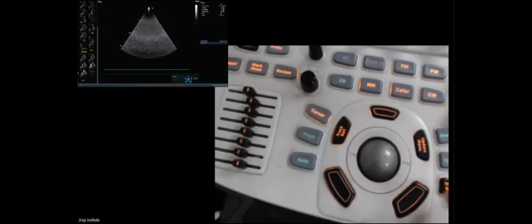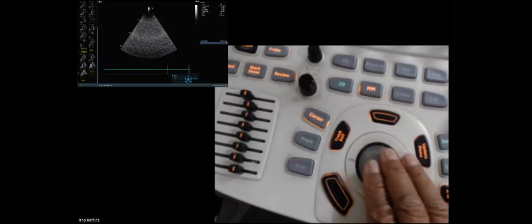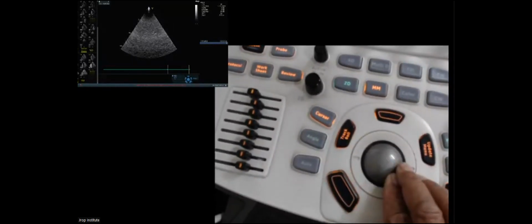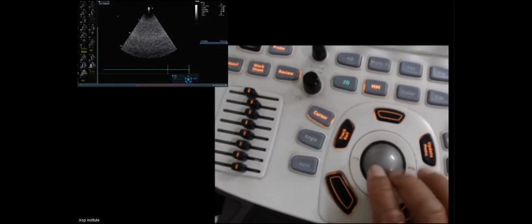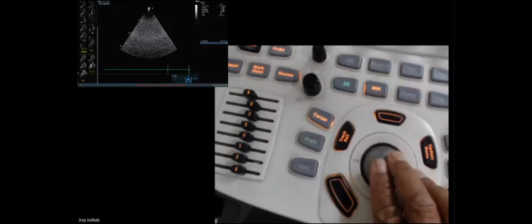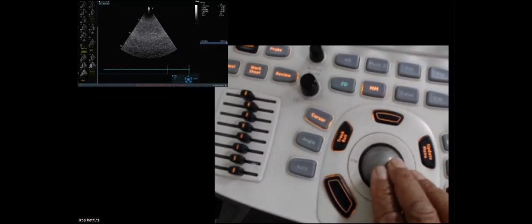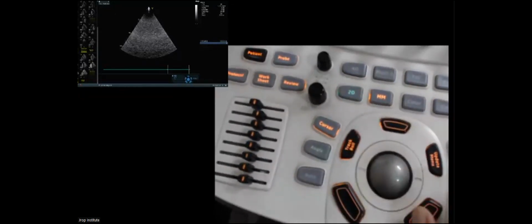Then on the right side of the screen, there is a word known as caliper. This caliper, if I freeze my screen over here, I can measure from one point to another point. So this is a distance between one point and another point, and it reads 3.41 centimeters in this particular fashion. So where do we use it? We use it for LVOT diameters, mitral annulus diameters, RVRA measurements. Many places we use this caliper to measure these kinds of things.